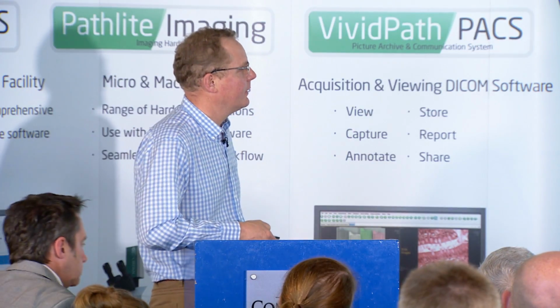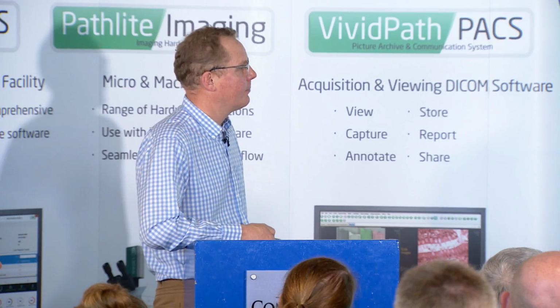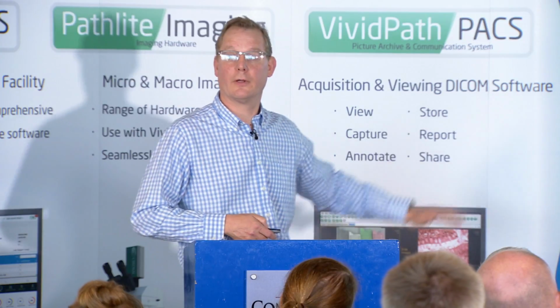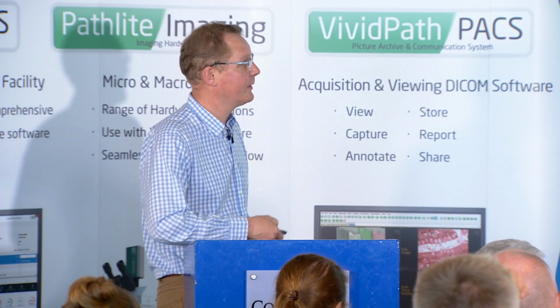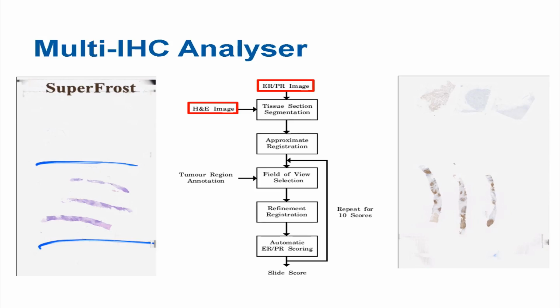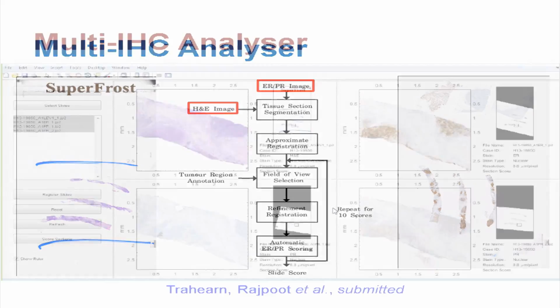and then to have the section stained and read by the computer independent of the pathologist. So everything that's downstream of that was done by the computer. No pathologists involved. They just made the diagnosis and told them where the cancer was. And this involved obviously an overlay step, a series of segmentation overlay steps where you get the immunostain overlaid alongside a H&E, so you know which bit of the core you're looking at, you know where the tumour is, etc.